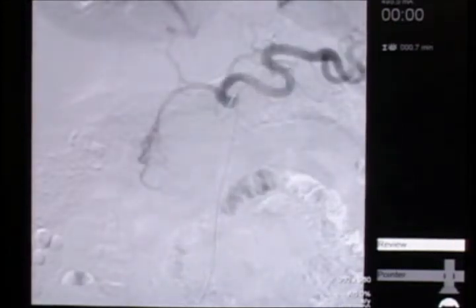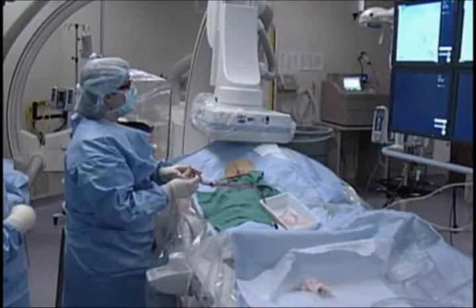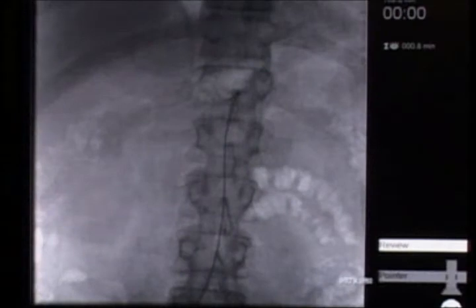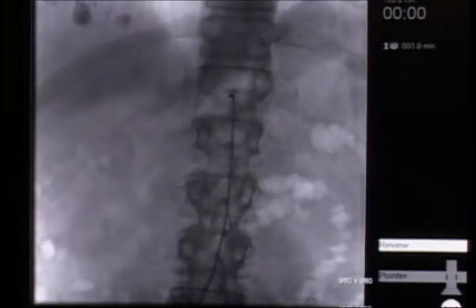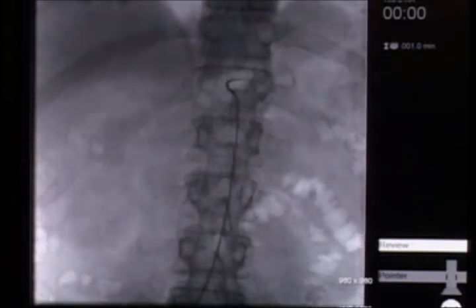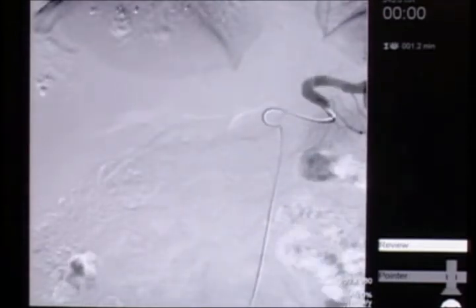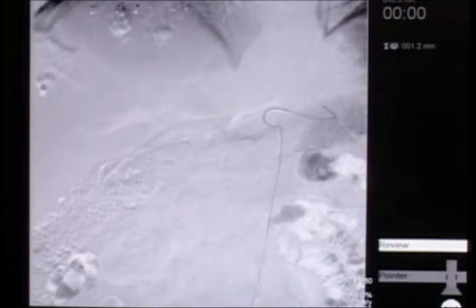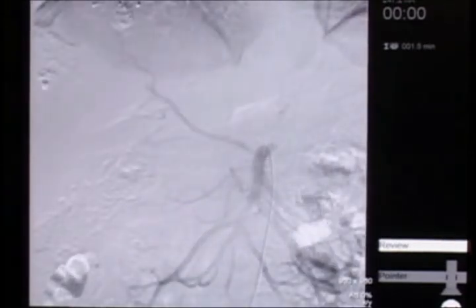On this picture in the right upper quadrant you see some dark spots — that's residual material within the liver. This is his celiac axis, and you can see the big vessel going off. To the right on the screen is a splenic artery. The vessel going to the left is the common hepatic artery, which splits into two vessels, and the smaller of those is the one we're going to treat today. This run is going to image the splenic artery and the portal vein to opacify it in the venous phase. This patient had a widely patent portal vein, and the two densities showing up on the non-subtracted images are the residual chemoembolic material.